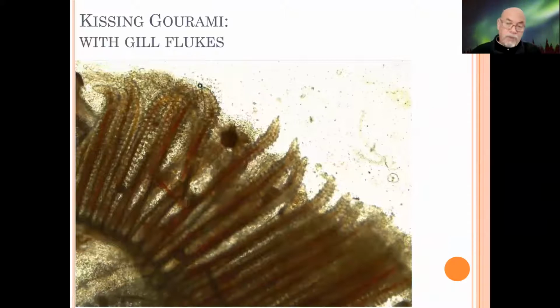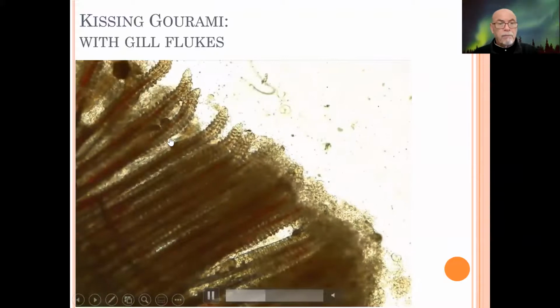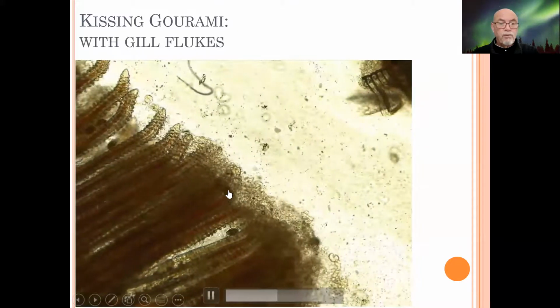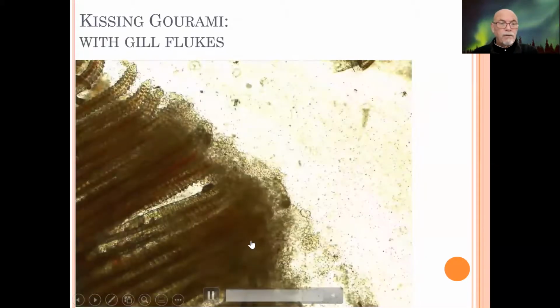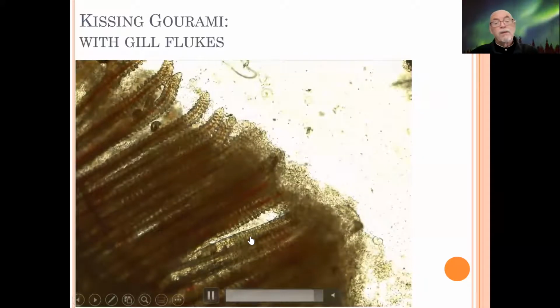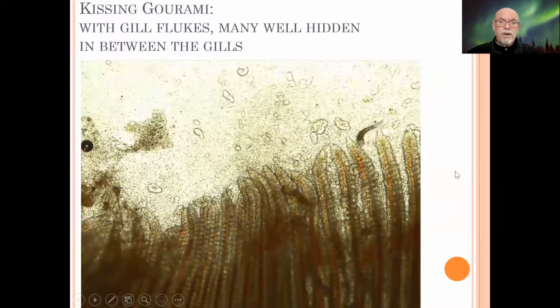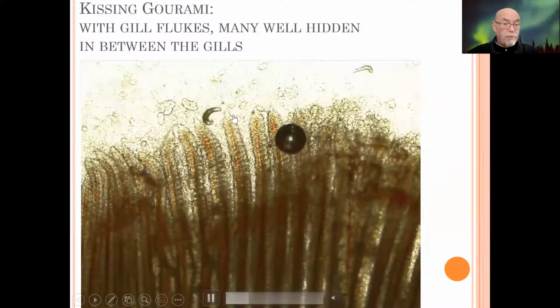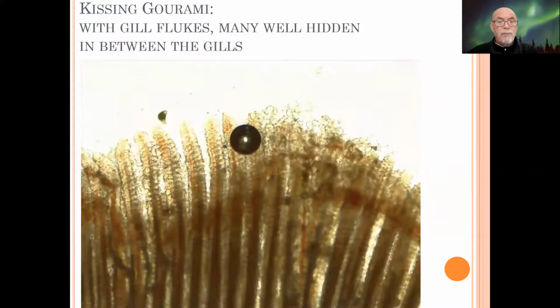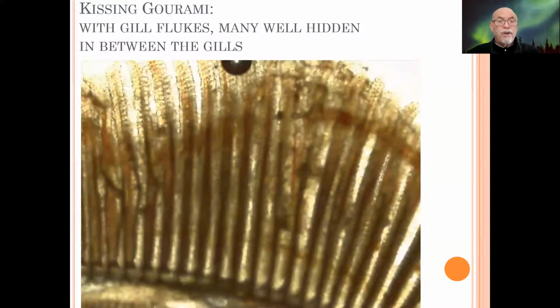And here we see the observation with the microscope of the gills. You see the dark objects here, the parasites, gill flukes, here and here. So few are loose into the water. And this is just an observation at the 200 magnification, I presume, yes. And show you one more here. You can see that some are moving away from the gills because on that moment when we take our sample tissue, it's not good for the worm. So he knows he wants to survive, so he tries to escape.